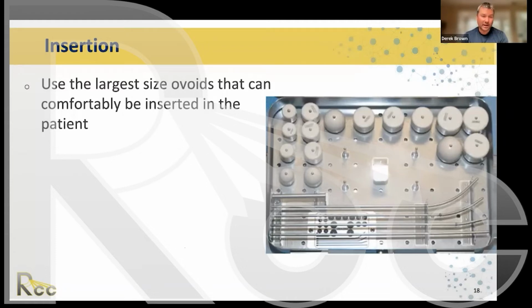So the downside is you can't really see where the cervix is. So it's going to be hard to do any dose optimization, right? It's going to be hard to dose optimize for the bladder, and it's going to be hard to dose optimize for the rectum. But this is still considered standard of care, and it's definitely possible. And if that is the best imaging that you have available, then you're better off to use that than to not provide patients with tandem and ovoid treatments.